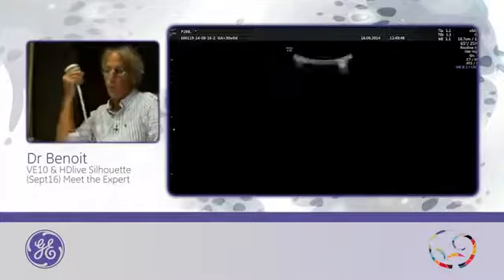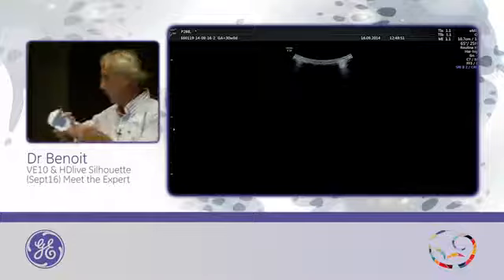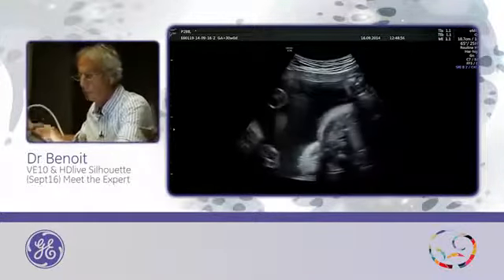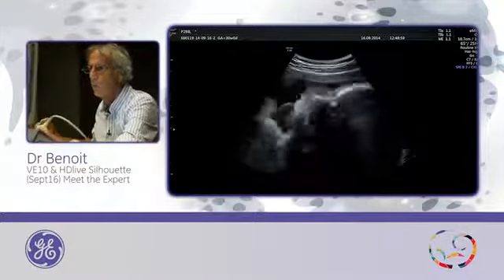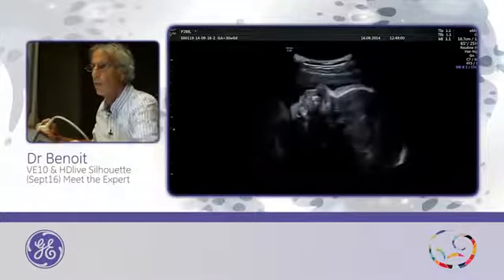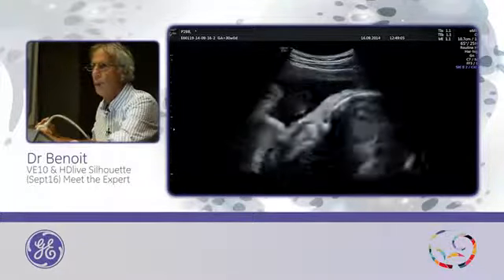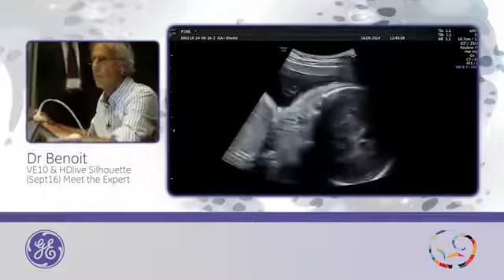So first I start with a new probe, electronic probe. So what I have to do first is to know the position of this baby. Okay. This is a nice view on 2D. And this is one ear.